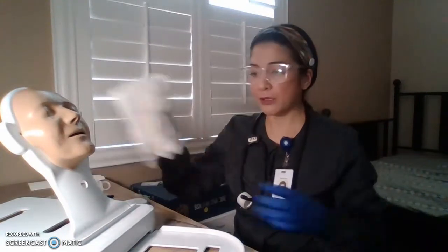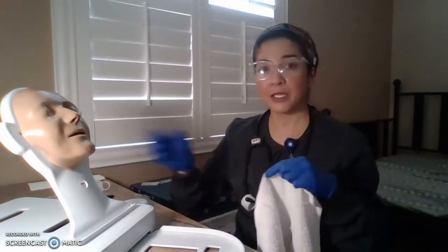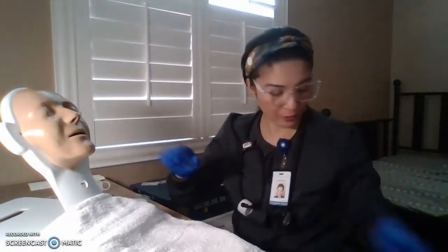We are going to prepare our patient. Make sure you are on a good working height. Protect your patient and protect yourself as well, okay? So we're just going to place this here just to cover.